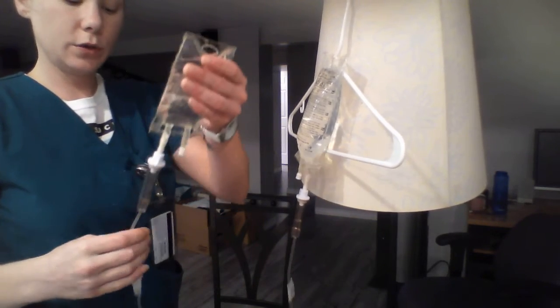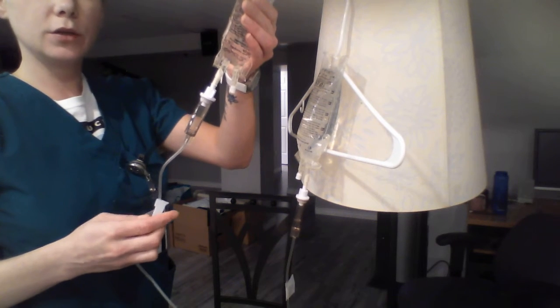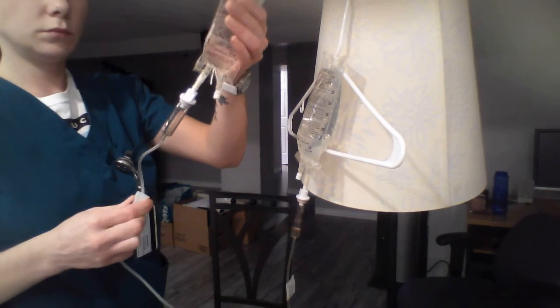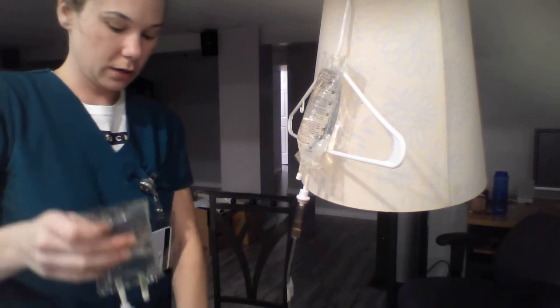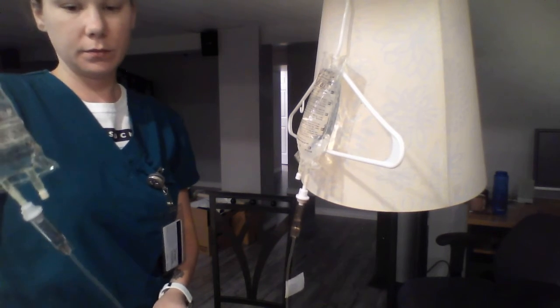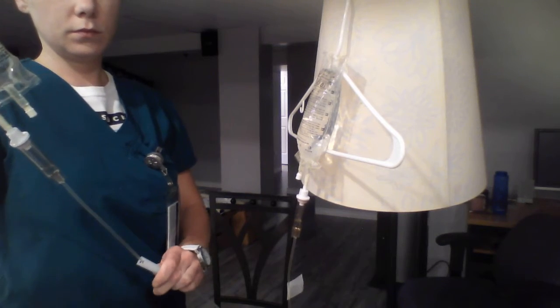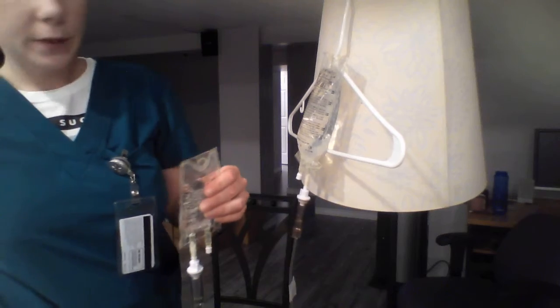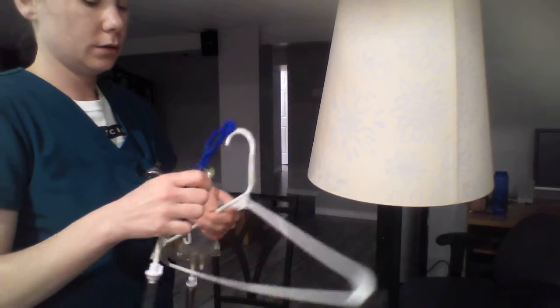So at this point, I'm going to open my mini bag to prime my tubing and hang it lower. Okay, I'm going to stop that. And now I want to take my clamp hook, I'm sorry.